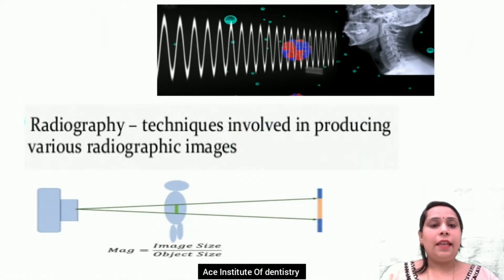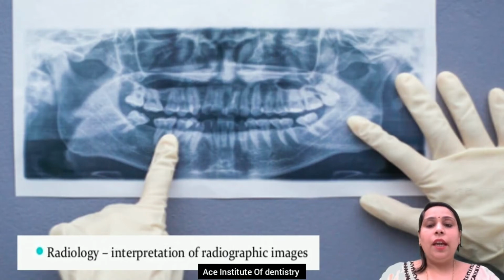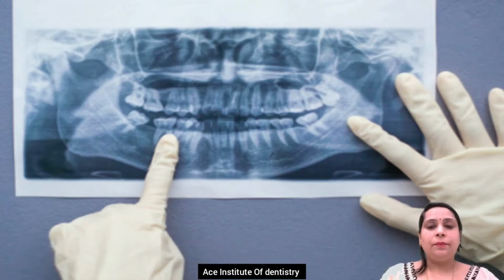Radiography refers to the techniques involved in producing various radiographic images. Here it can be an extraoral technique or an intraoral technique. Radiology is the interpretation of the radiographic image. That can be small IOPA films or a big OPG, whatever it may be. When we are giving any diagnosis or treatment plan and interpreting it, that study is called radiology.